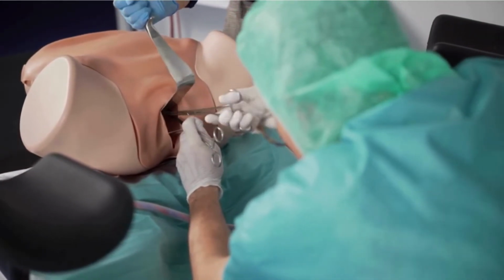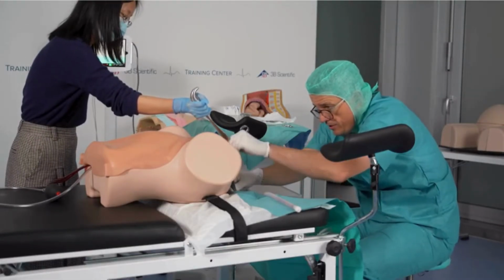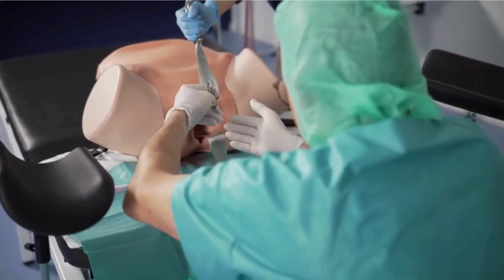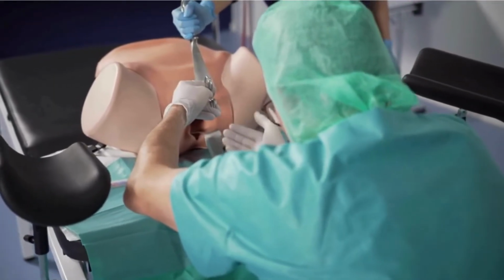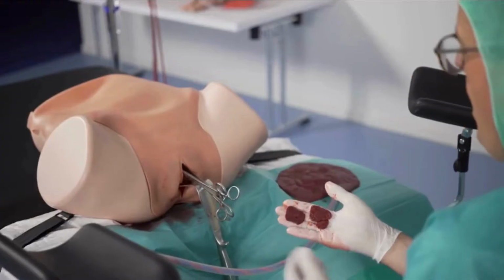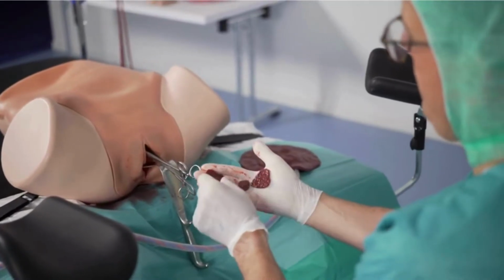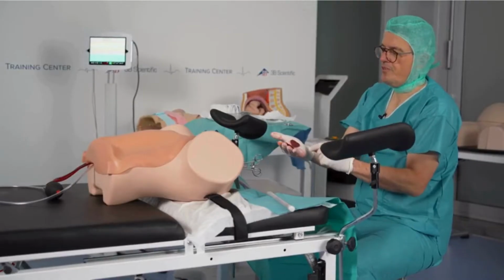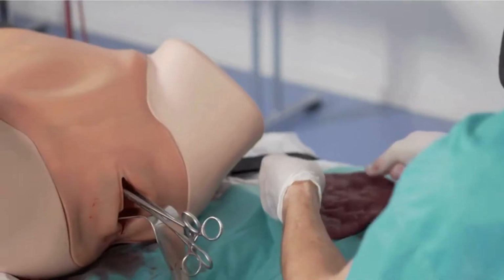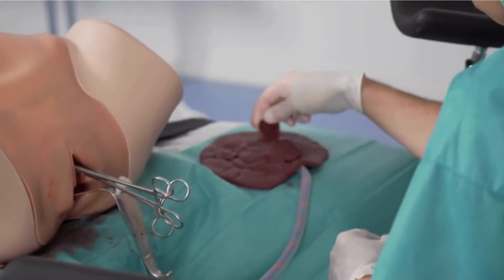You can take a second clamp to hold it, and then, like in a typical obstetric situation, you can easily proceed to do a curettage, and you can remove the placental residuals from the uterus easily. After doing the curettage, you can easily see that we found the placental residuals. We retrieve them from the uterine cavity, and we can check if everything is complete. It's 3 little residuals missing.